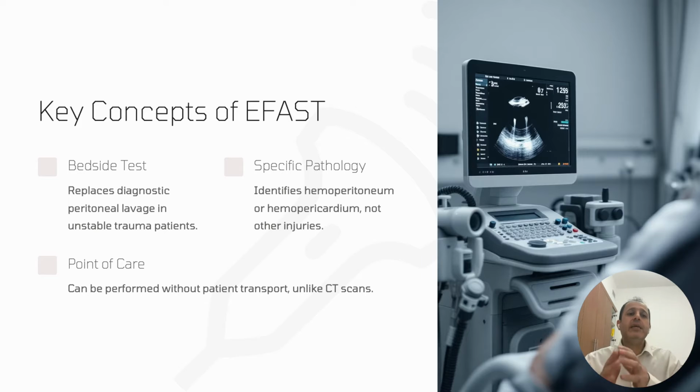If we go back to traditional practice, for many trauma patients they did DPL, diagnostic peritoneal lavage. But right now, thanks to ultrasound, we can use EFAST to detect free fluid.